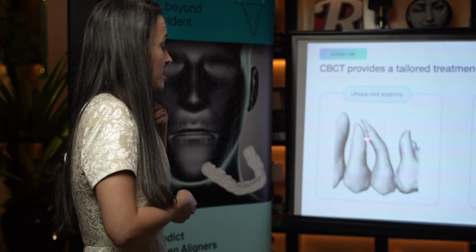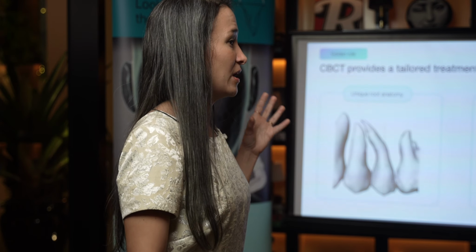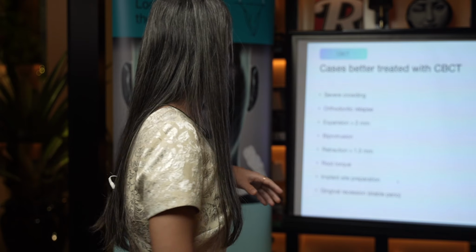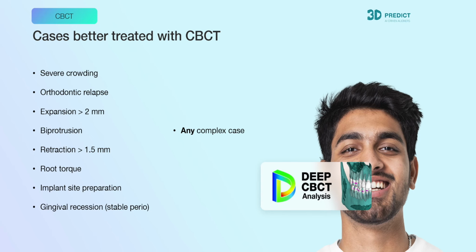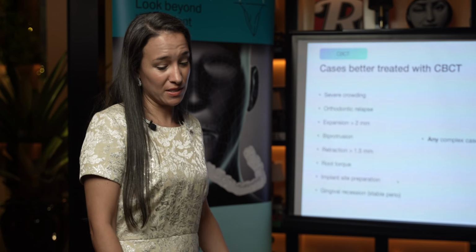So this is unique because it doesn't happen with every patient, right? But if you do see this and you know there's a lot of movement that you want to achieve, CBCT is always best. So this is all the instances where CBCT is actually preferable. And you can take a picture for all your cases, so you can go back and refer to this. But I don't expect you to have that picture in front of you every time you're going to submit a case, right? So just know, if we think that your cases tick any of these boxes, we are going to reach back to you and say, doctor, a CBCT is best in this case.